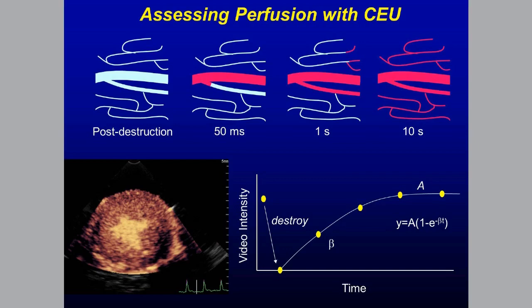And then when you're using the commercially produced enhancing agents, we generally have turned off the infusion, or it's been a long time since our last bolus injection, that we start getting our TR jet signal for the same reason. Exactly. And you can even turn on your regular imaging mode to eliminate some of the contrast that's in the cavity if you don't want to sit there and wait too long. Yep.